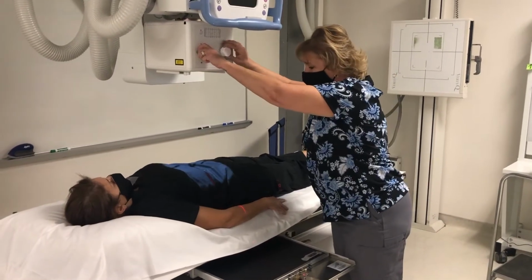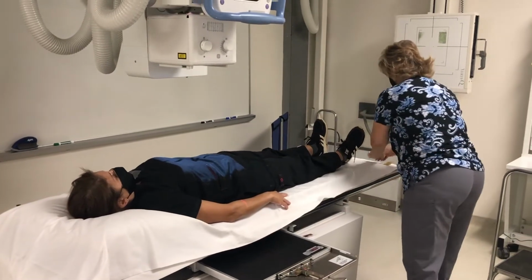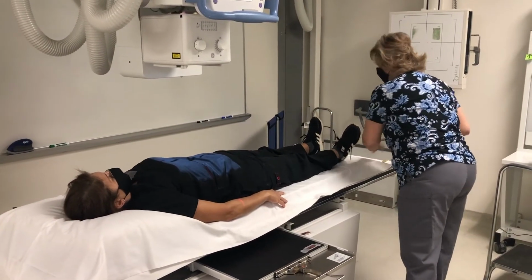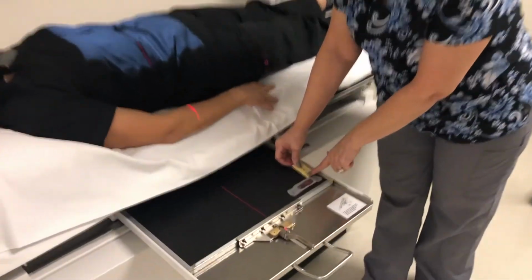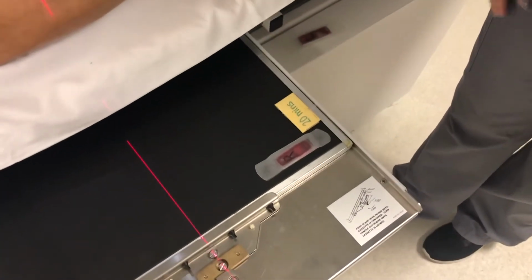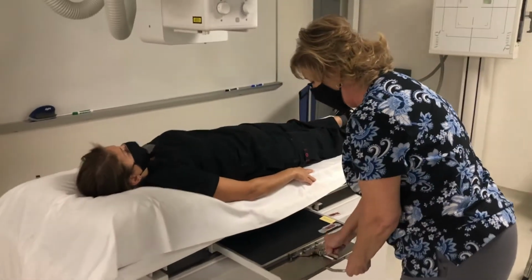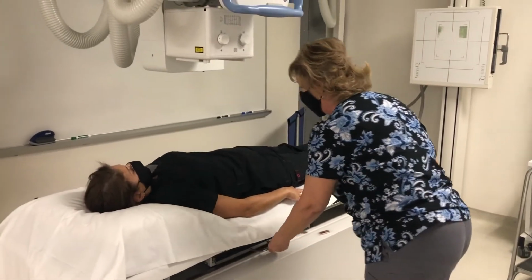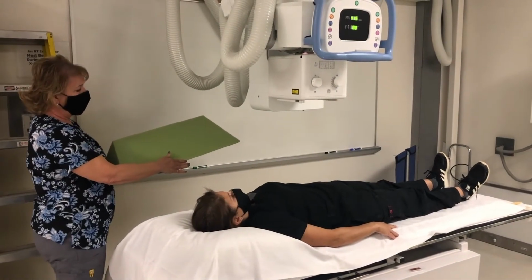So I'm 14x17 again. Now, I'll probably be doing 20-minute obliques. So I would put a 20-minute marker on here. And I'm going to take both an RPO and an LPO. So this is a 45-degree sponge.